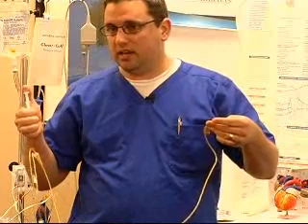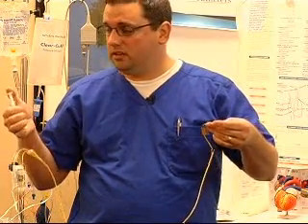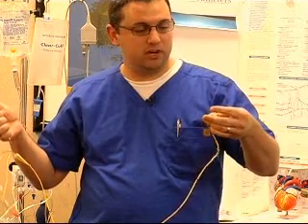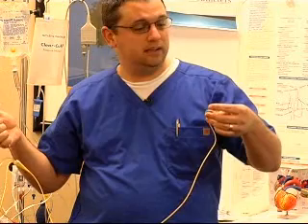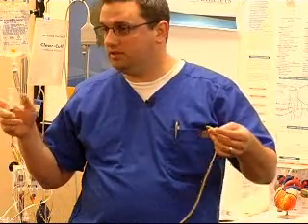Now, it's always a good idea to check it again, just to be sure that you're going to be able to get it to wedge again. Just let them know what you're doing, communicate to the practitioner so they're not repositioning the line. Try to wedge it again. Hopefully your wedge waveform comes right back up, and you're going to be able to see that on your PA tracing. So that tells you you're in good placement.